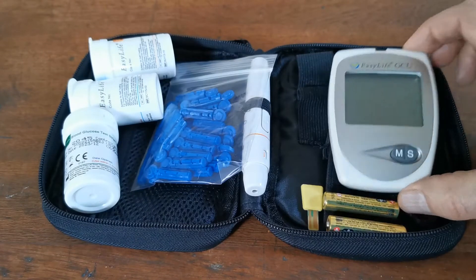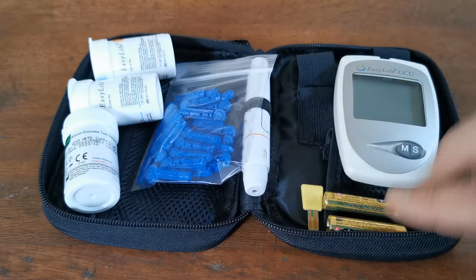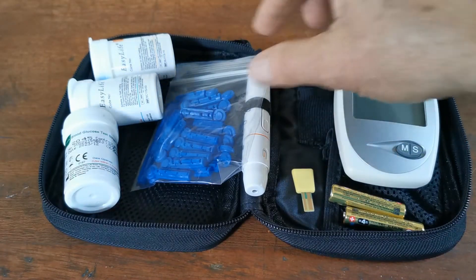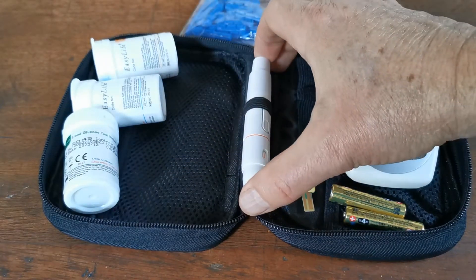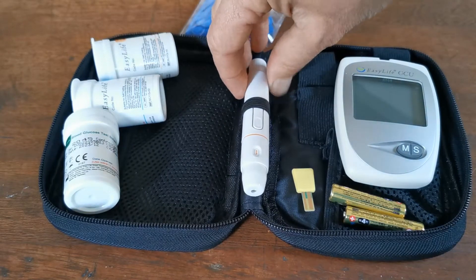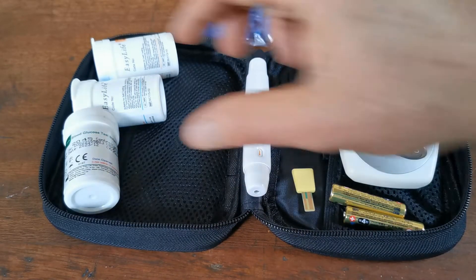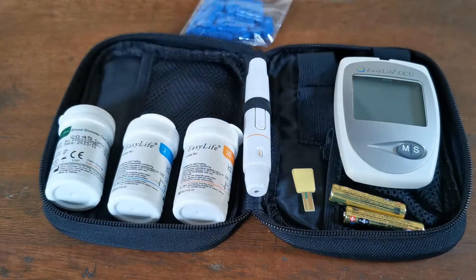Also obviously included is the digital meter, two triple-A batteries, a reset code chip, lancets, and a spring-loaded EasyLife lancet device — which is one of the better ones on the market with variable depth settings — and you get three starter packs of test strips.